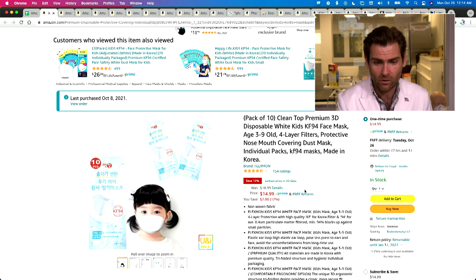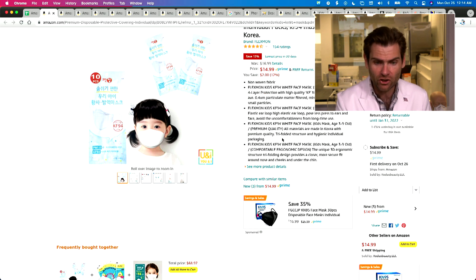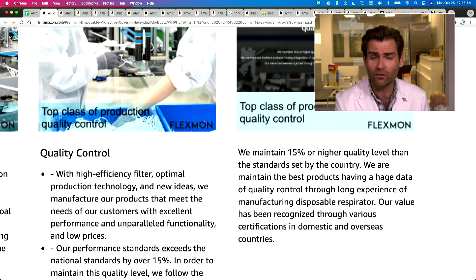I know this is a KF94, so that means it should pass that 94%. This seems to be legitimately made in Korea. I say that because we've had a bunch of fakes on here recently that are made in China. They maintain a 15% or higher quality level than the standards set by the country.